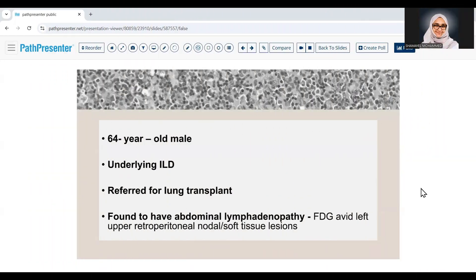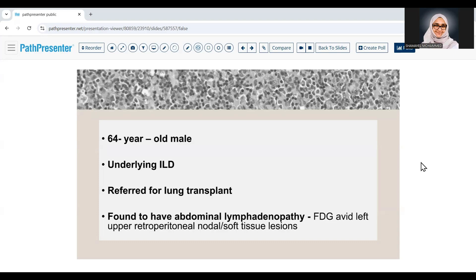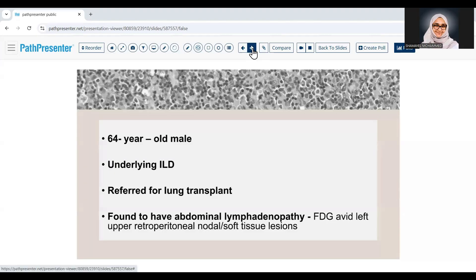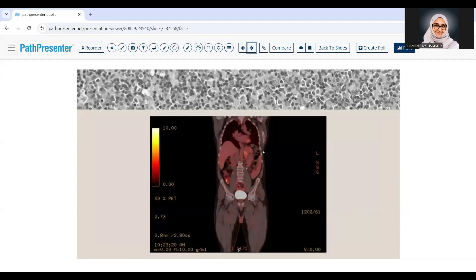Okay friends, let's start with our first case. Our patient is a 64-year-old male with an underlying interstitial lung disease. He was referred for lung transplant and found to have abdominal lymphadenopathy. The PET scan showed FDG-avid retroperitoneal soft tissue mass, which was worrisome for lymphoma.